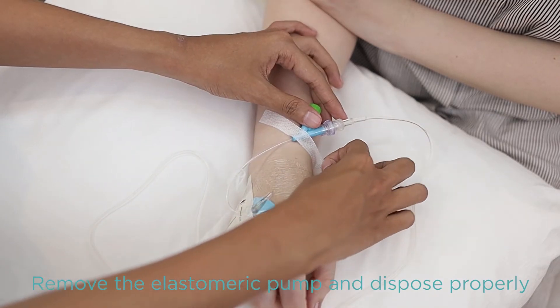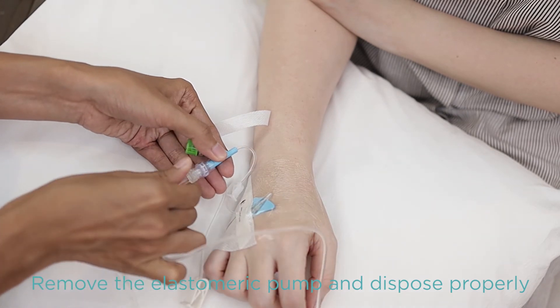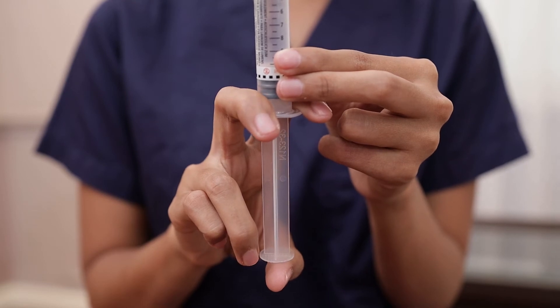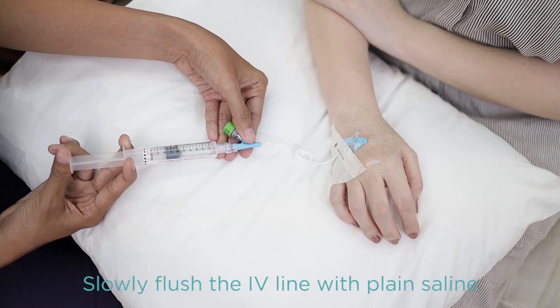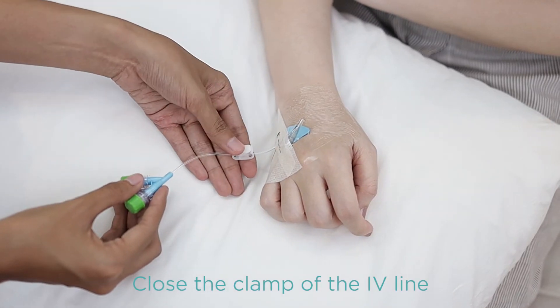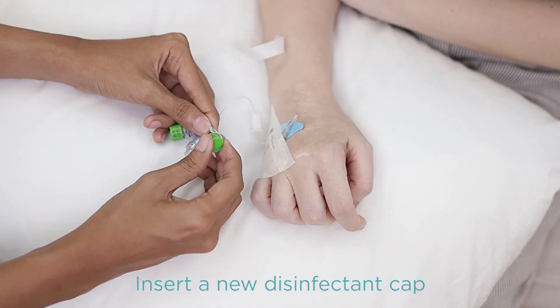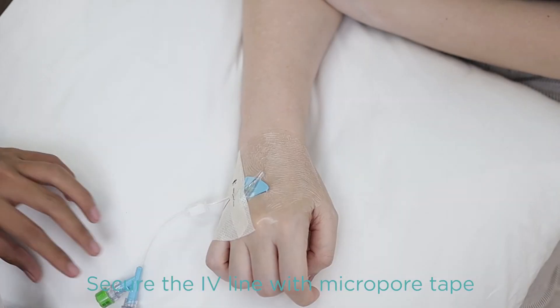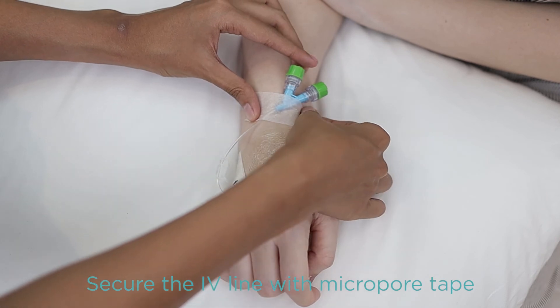Once the infusion time has been reached, remove the elastomeric pump from the port connector and dispose properly. Prepare the pre-filled saline syringe by again pushing the air out and slowly flush the port connector with a pre-filled saline syringe. Close the clamp of the extension tubing of the peripheral IV line. Insert a new disinfectant cap. Finally, secure the extension tubes to the skin with a micropore.